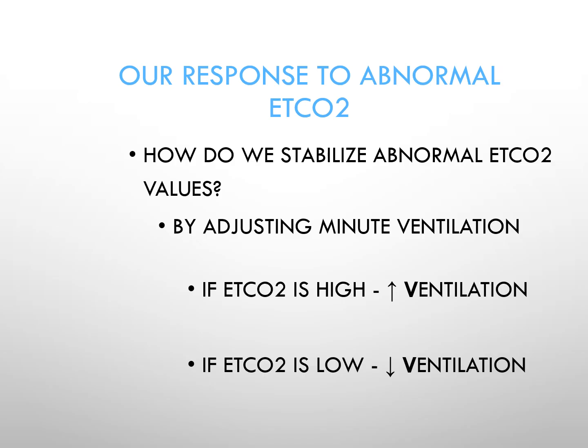If that's not the case, the patient may actually be alkalotic. They're not compensating for anything. They're in pain, they're anxious, they're just hyperventilating. In which case the team needs to treat the underlying cause. If they're anxious, try to alleviate their angst by interacting with them, but they may need some medication to do that as well. If it's a case of pain and they're breathing quickly because they're in a lot of pain, then obviously the pain needs to be treated as well in order to try to normalize the end-tidal CO2 and the blood gas.